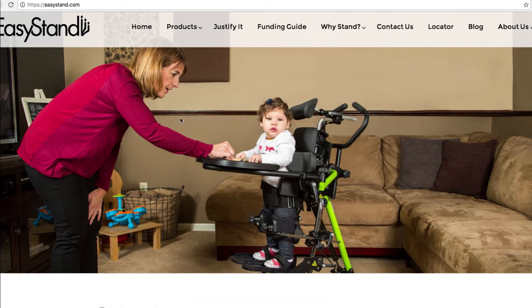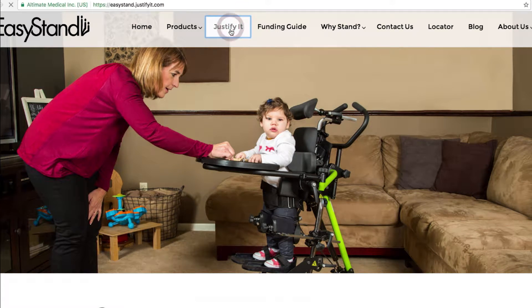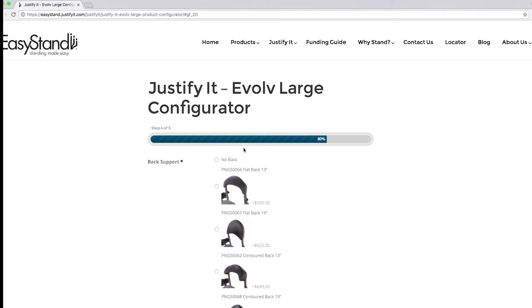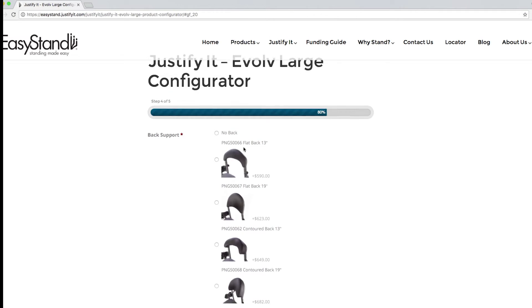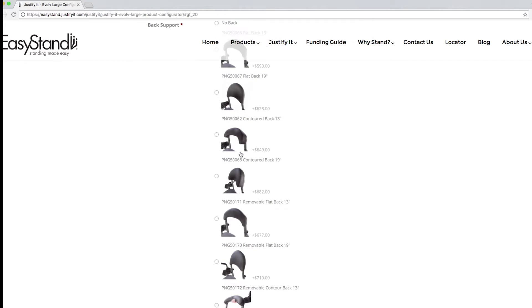Justify It features an easy-to-use, intuitive interface and uses conditional logic to prevent improper selections. For instance, you can't select a headrest until you have a back to mount it on.